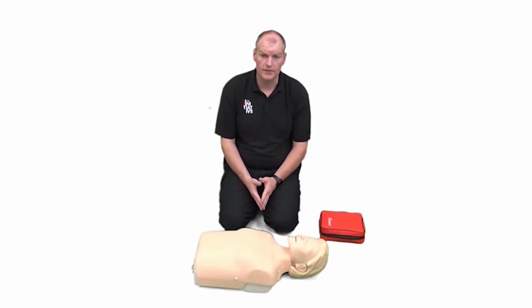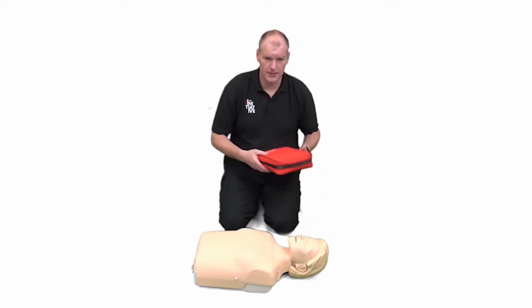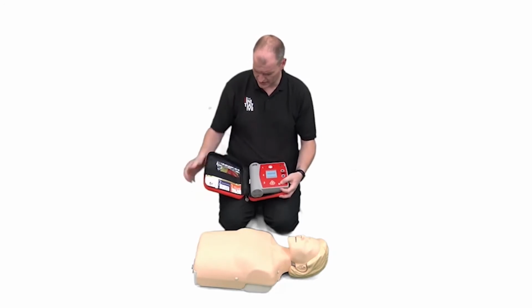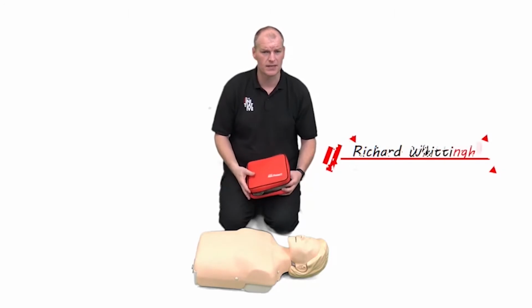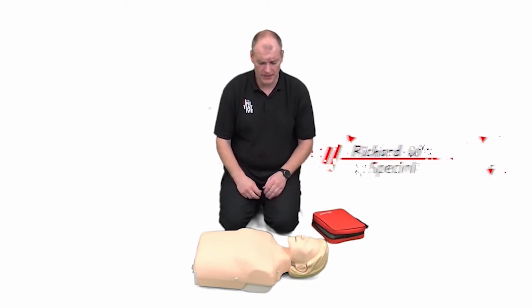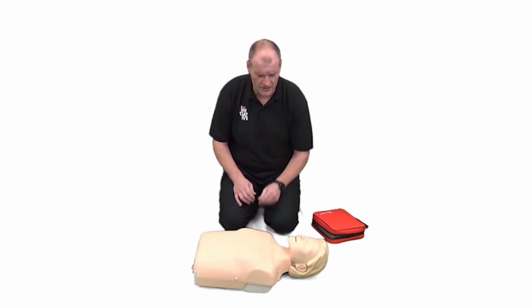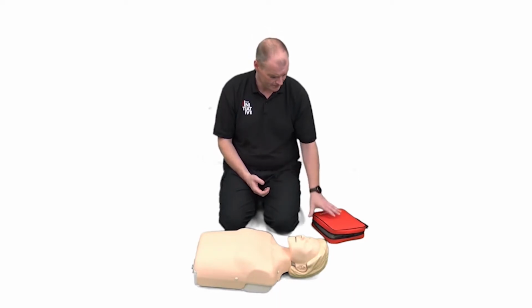In this video, we're going to have a look at how to use an automated external defibrillator, or AED. So first thing we need to do is get hold of the pack and open it up. And inside we should find that we've got the AED unit, a set of pads, and you should also find in there as well that there is a towel, a razor and a face mask. So the first thing we're going to do is remove any clothing from the casualty, and if they do have a hairy chest, we're going to use that razor to shave away the patch of hair, as the pads need to go onto bare skin.